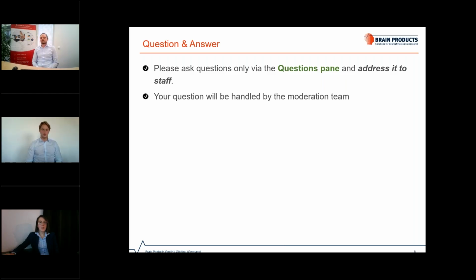One last question has come in for Bastian, and it is about the N4 sleep stage. There is no button shown in the solution for that. Can you please explain why? Yeah, we decided not to have an N4 staging button available because the guidelines by the American Academy of Sleep Medicine have changed in that manner.